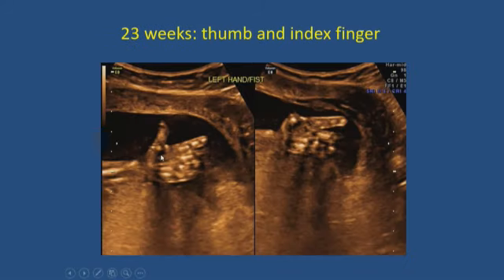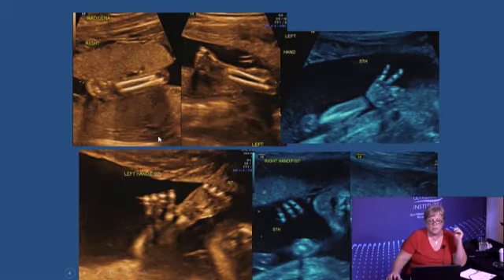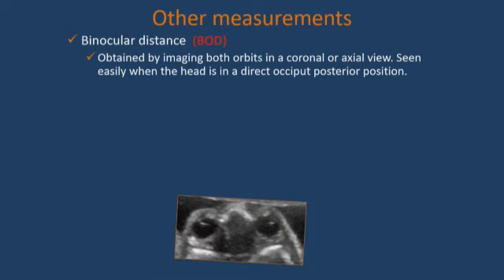If you can get the thumb up, we do look at that in some of our genetic syndromes, because some of them have adduction where they're pulling the thumb in, or abduction way far away with different genetic syndromes. And this is just showing you how the different things work with putting on the filter. Almost all the machines, even the little laptop ultrasound machines, have these little color filters that you can put on. So if you use these little chroma maps, they can actually help you to see the bone a little bit better.